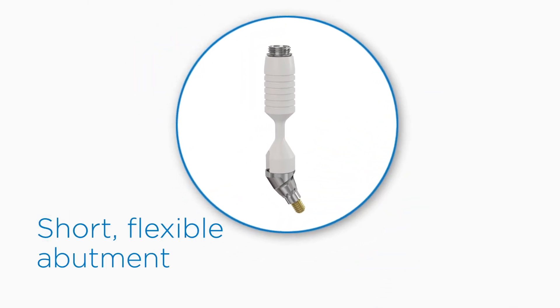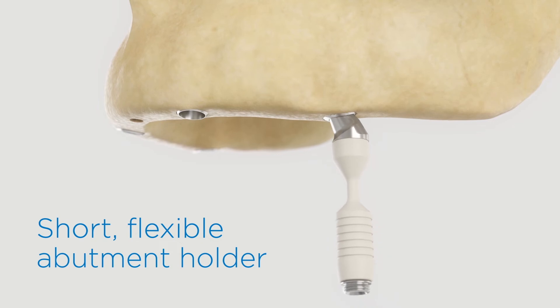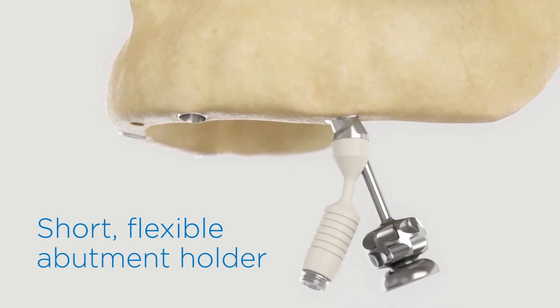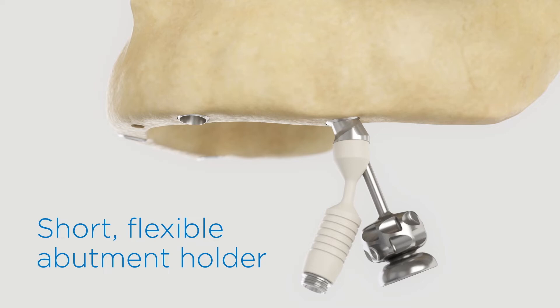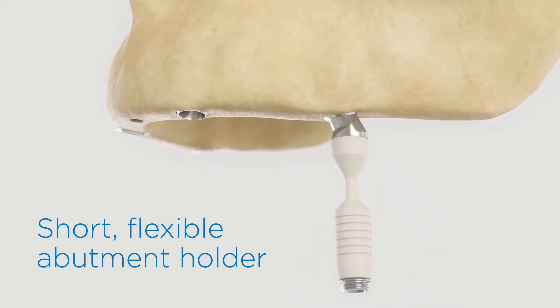Then there's the short, flexible abutment holder. Unlike holders made of metal that require workarounds in handling, this plastic holder can bend in any direction, making it easier to find just the right angle for abutment seating even in tight or harder-to-reach spaces.